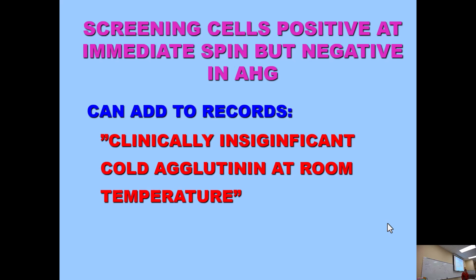What we add to records in this situation is something along the lines of, depending on where you're at, they'll have exact wording, clinically insignificant cold agglutinin at room temperature. Just so we know, yep, we found it. That'll help the next person know that, yep, this was found before.